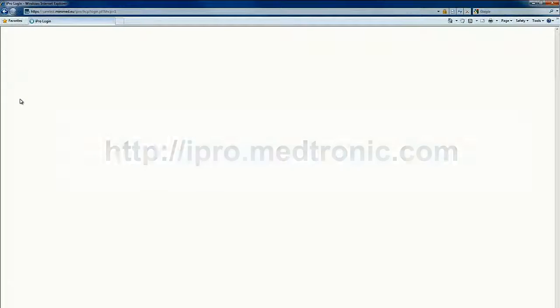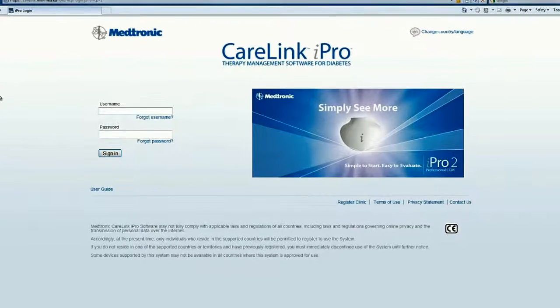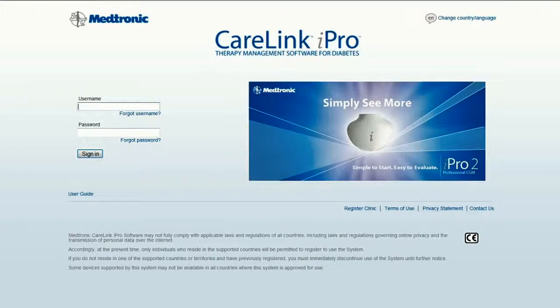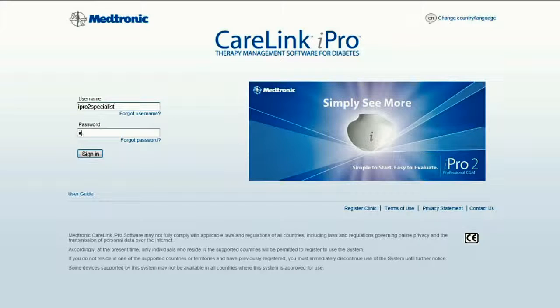For easy access, you can add a bookmark to your favorite places or create a link on your desktop. This is the sign-in page. When you receive your first iPro 2, you will do a one-time clinic setup by clicking Register Clinic. Upon successful setup of the clinic, simply enter the username and password to sign in.